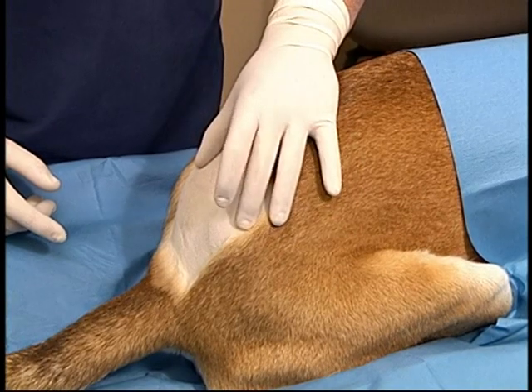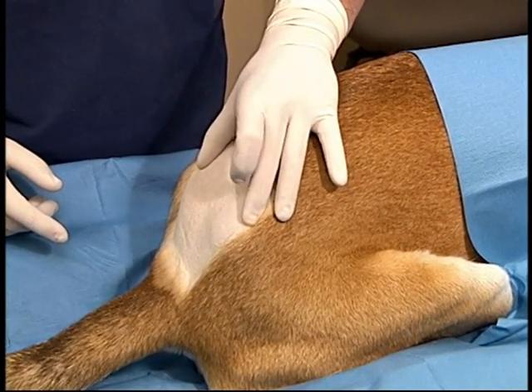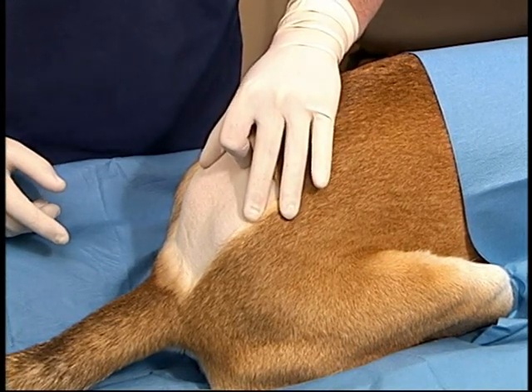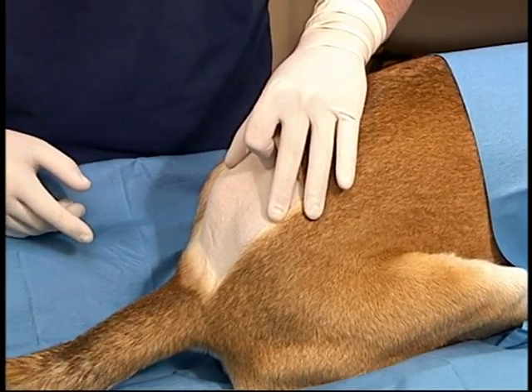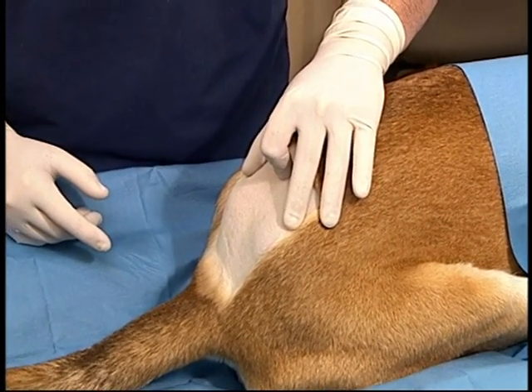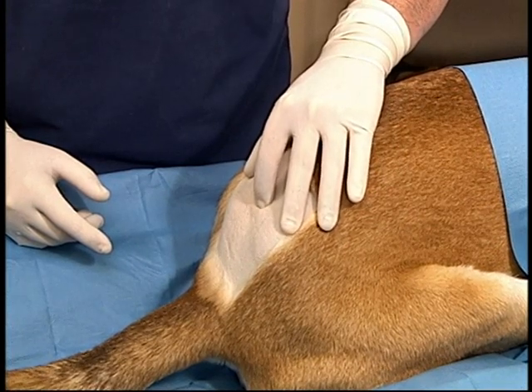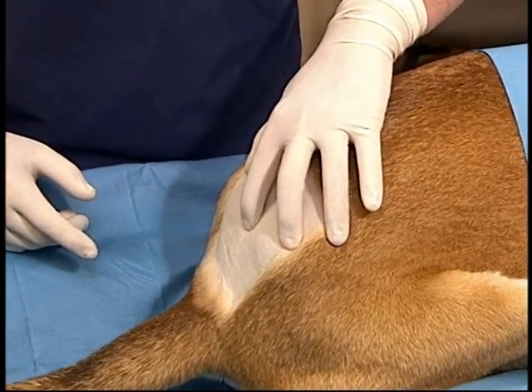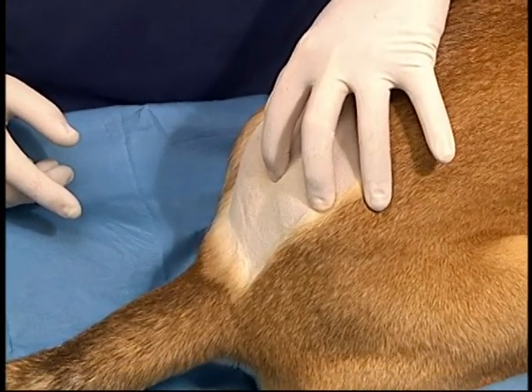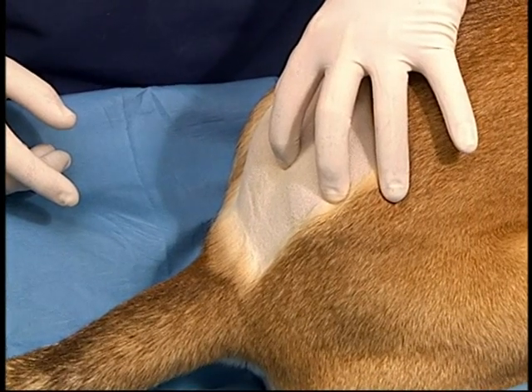of the needle. The cranial aspect of the wing of the ilia are identified using the thumb and second finger of the non-dominant hand. The index finger of the non-dominant hand palpates for the dorsal spinous process of L6. The dorsal spinous process of L7 is very short and in obese animals cannot be palpated. The index finger then proceeds caudally until a significant depression is located. This is the location of the lumbosacral space.